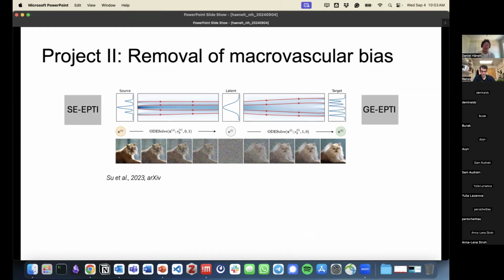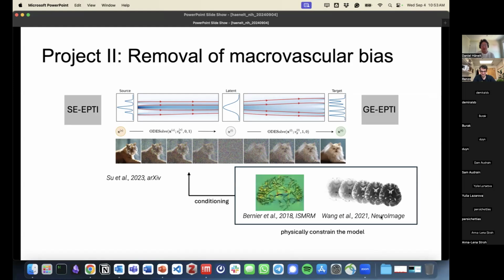We expect a purer T2 weighting than if we use spin echo BOLD with a single readout train, and it also produces a lot of images during the echo train.